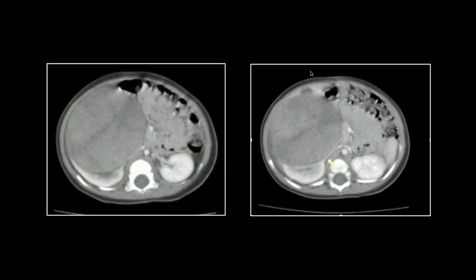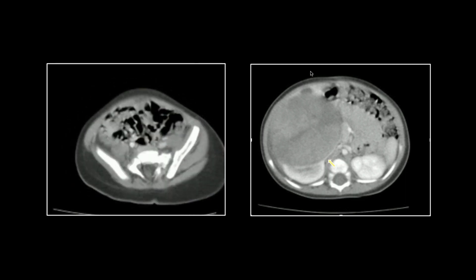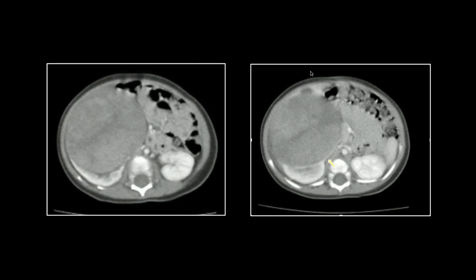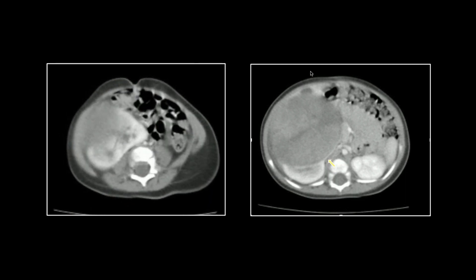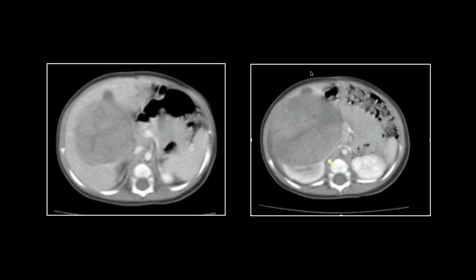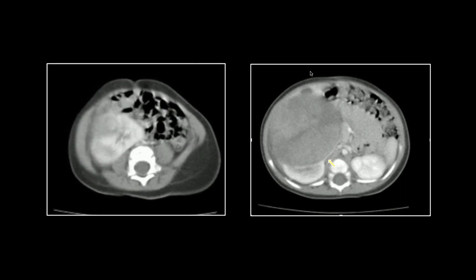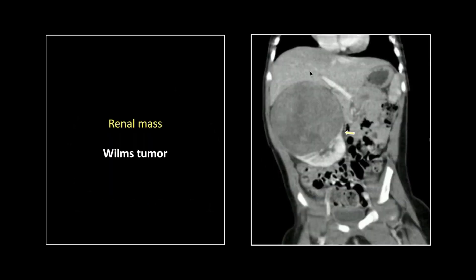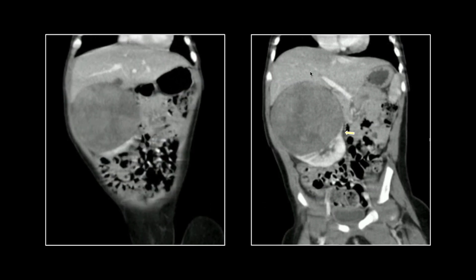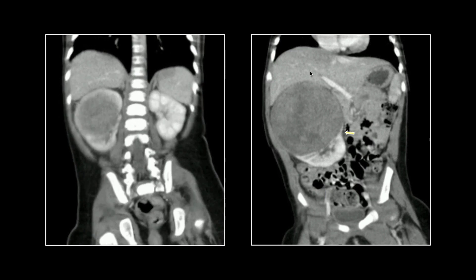These can be pretty confusing in terms of what organ they originate in. You have to look in all planes, but always look for that claw sign — it really suggests this came from the kidney. Let's look at that one more time. On the coronal it really helps to tell the story; there's that claw sign again.